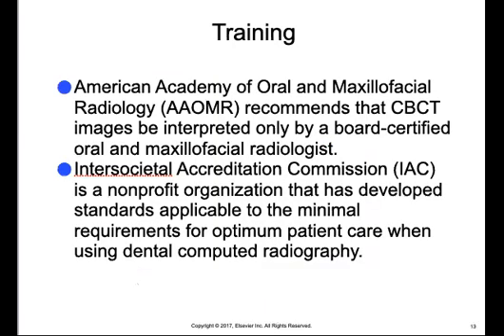Okay, so moving on here. Most dentists who use CBCT imaging techniques do not have the formal training that is required to interpret the data on anatomical areas beyond the maxilla and the mandible. So it's not that they can't view this or they don't know how, it's that the scope of practice doesn't allow them to view beyond that maxillofacial complex.